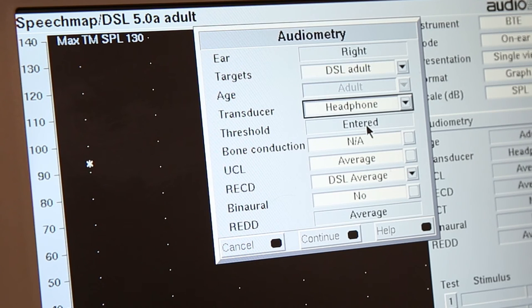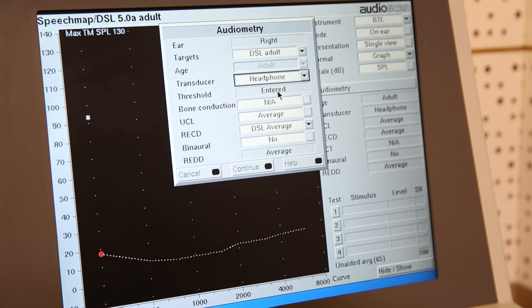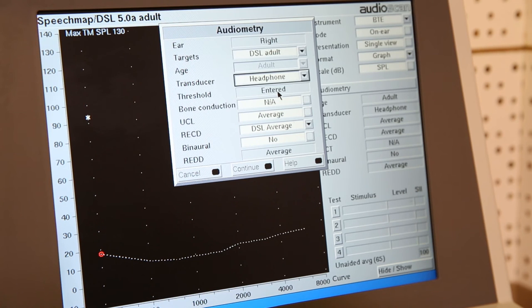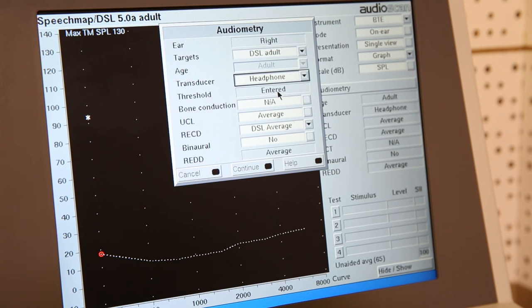Next, you choose if you want to add in your BC results. You will only need to do this when there is a conductive component, as an air-bone gap will result in a target that provides slightly more amplification than would be necessary for a sensorineural hearing loss.